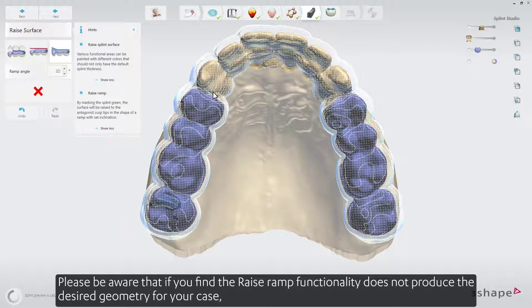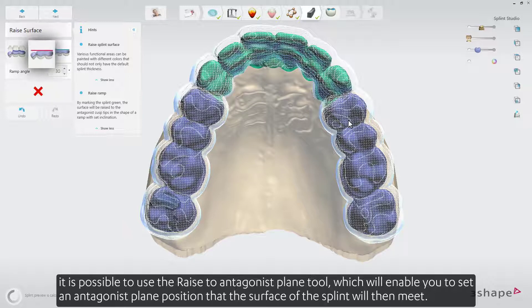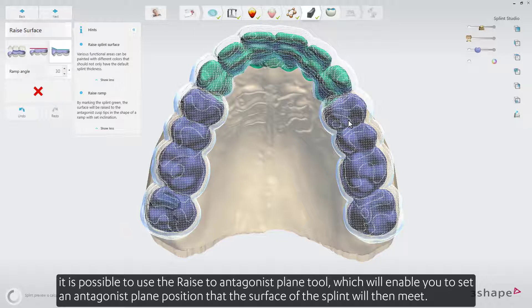Please be aware that if you find the raise ramp functionality does not produce the desired geometry for your case, it is possible to use the raise to antagonist plane tool, which will enable you to set an antagonist plane position that the surface of the splint will then meet.